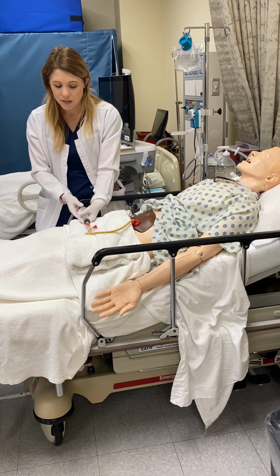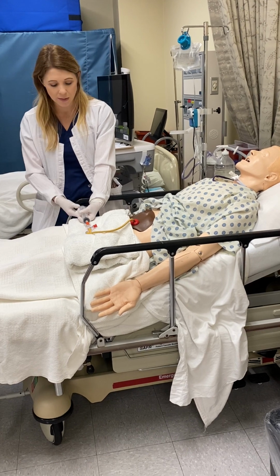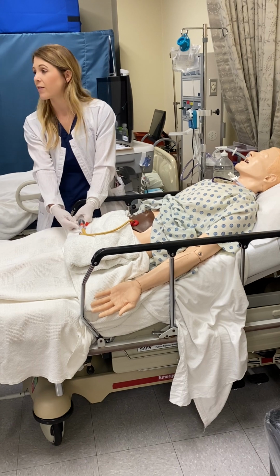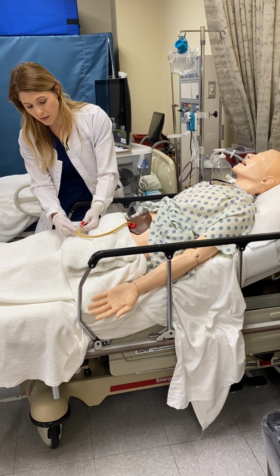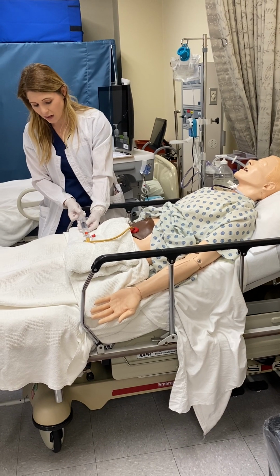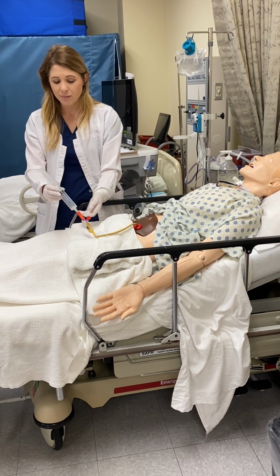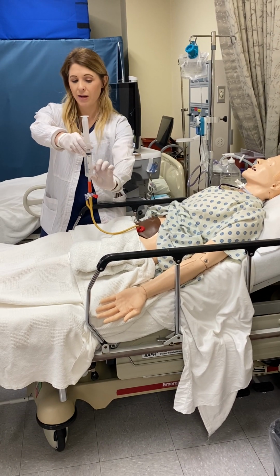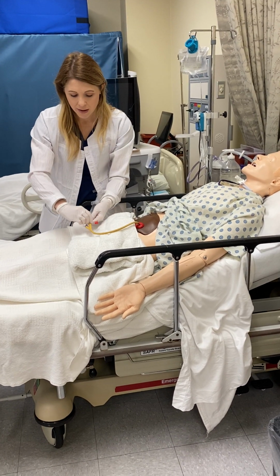So for now, just for checkoff reasons, I want you to verbalize that I'm gonna check a residual. Excuse me, I'm not gonna get one, right? I'm gonna have resistance because I never opened him back up. So I'm gonna open the stopcock, and I should be able to pull back on the plunger. Sometimes you'll get resistance, and see how much I have as residual? Do you see what I have here? Okay, so I'm gonna turn it back off.